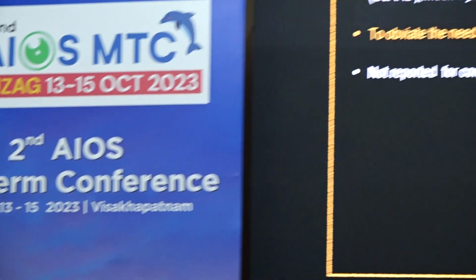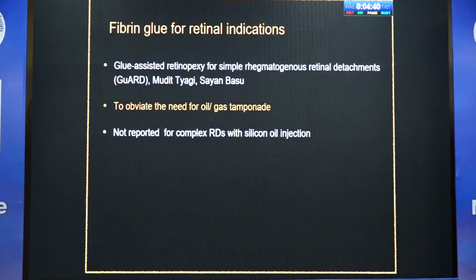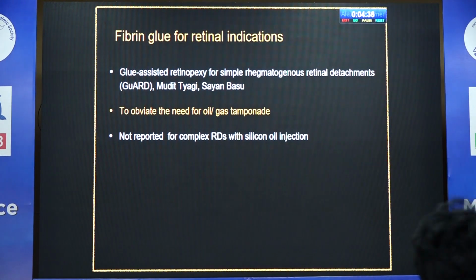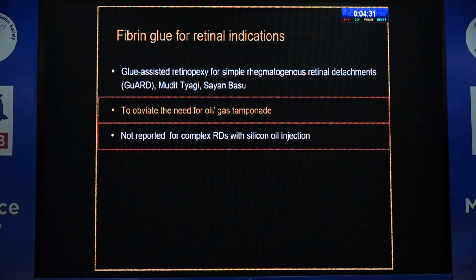So I'll be just talking about my experience with fibrin glue to close retinal breaks successfully in complex retinal detachments with silicone oil in situ. Fibrin glue has been used in ocular surgery for corneal purposes, and it has also been used in simple retinal detachments where it was used to obviate the need for tamponade. It was used to close the breaks, and then oil and gas was not required. However, it has not been reported for complex retinal detachments where oil is retained.